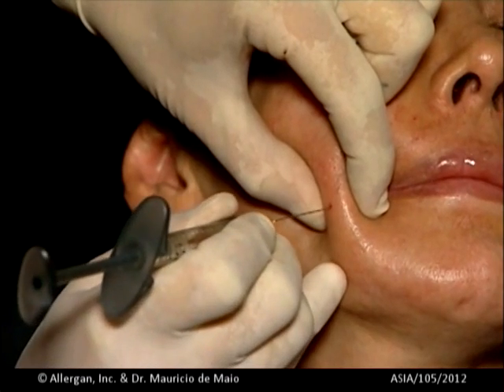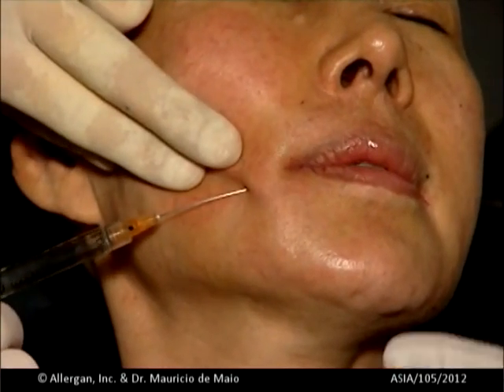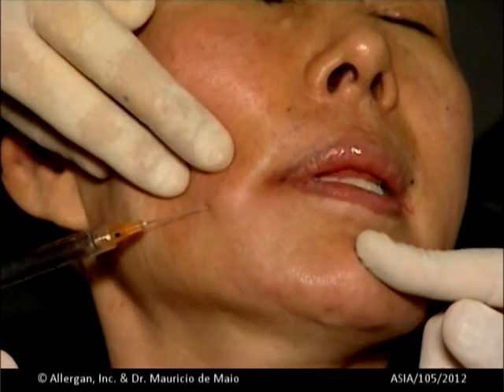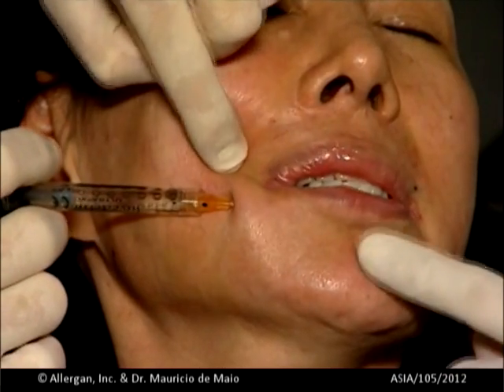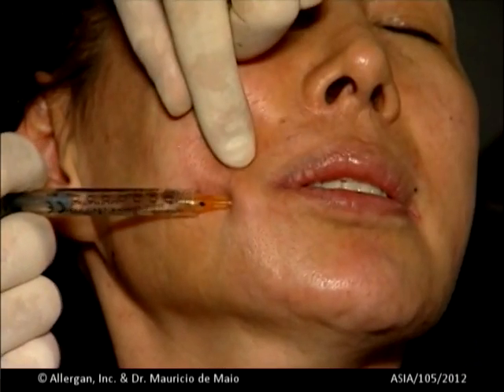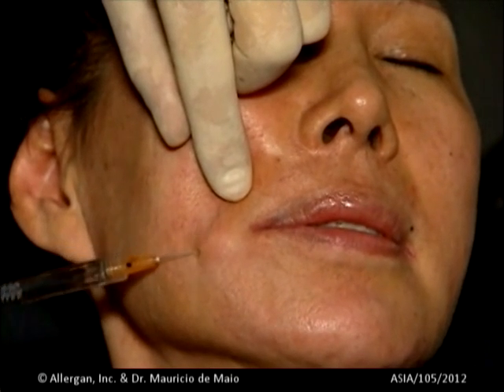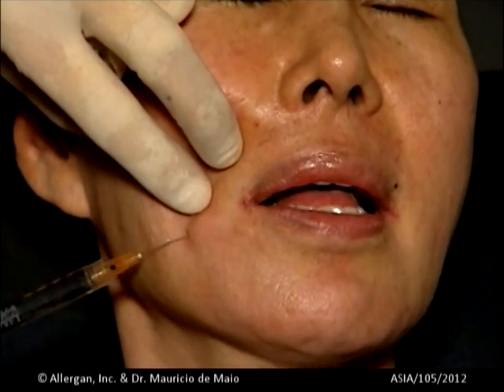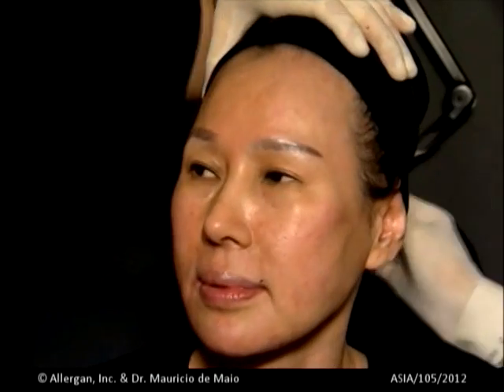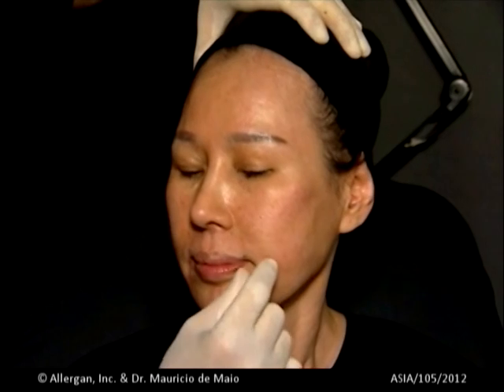Another entry point and the change to Juvederm Ultra Plus. Getting the product through a cannula in the body of the lower lip, we proceed with the filling and replacing volume. Retrograde. Check and reinforce the mucosa at the oral commissure. And again, a more lifted and correction at the oral commissure and marionette line complex is obtained.